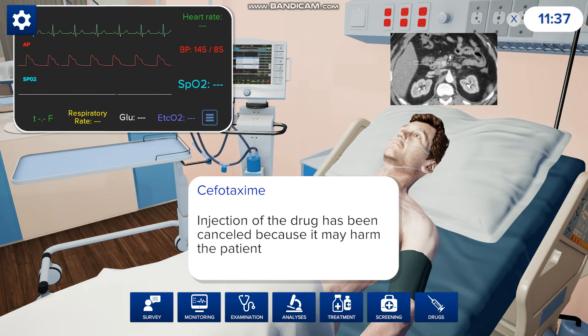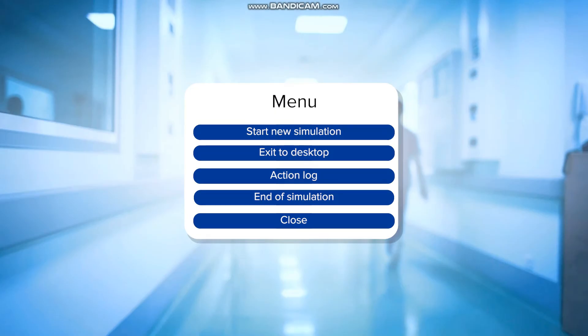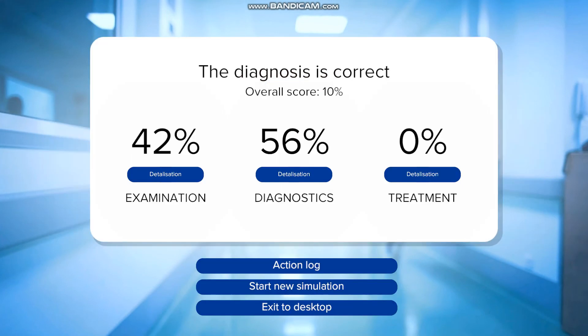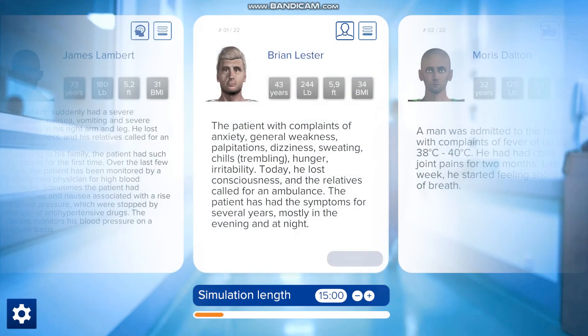Once you're finished with the examination, it can either take you the full 15 minutes or you can stop early if you have a diagnosis. You can go to the cogwheel in the top left corner and press end simulation. That's going to bring you to a screen where you choose your diagnosis — in this case it was hypoglycemia, and my diagnosis was correct. It will also give you a percentage of how well you did: I did 42% of the examination, 56% of the proper diagnosis, and I didn't do anything to treat hypoglycemia. Once you've finished that, you just press start the simulation and you can pick anything else that you want.